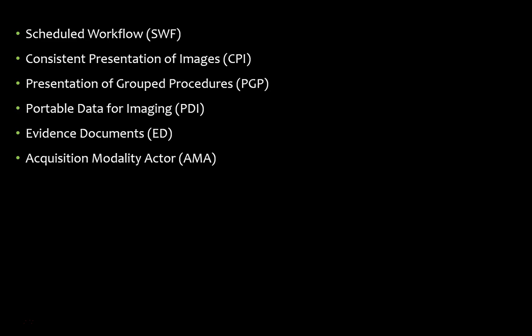CPI allows the technologist to set up initial presentation settings on the modality instead of requiring the radiologist to do it at the time of interpretation. PGP enables the modality to perform grouped procedures, for example, CT chest, abdomen, pelvis, without disrupting the reporting or billing chain. PDI enables creating DICOM-compliant image CDs on the modality. ED enables image measurements to be acquired with the modality and stored on the PACS.